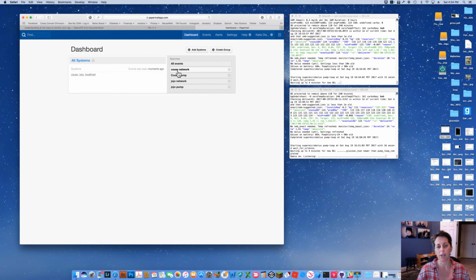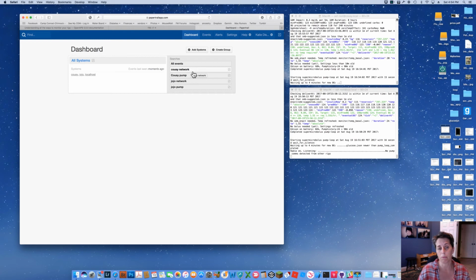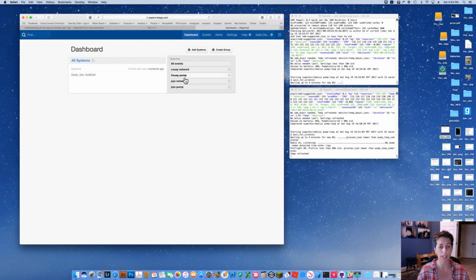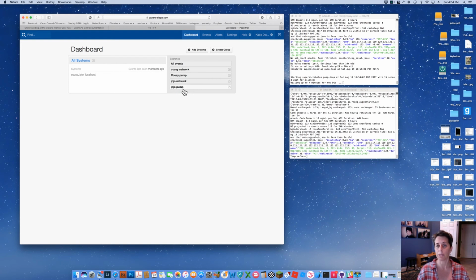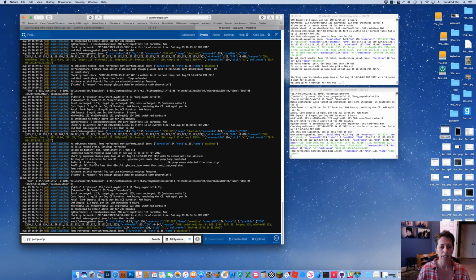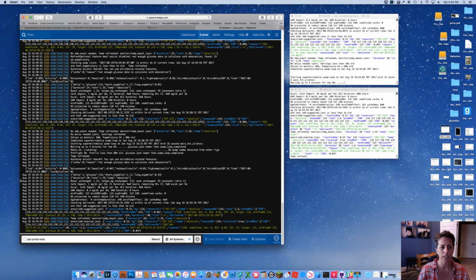Awesome. So now we have some really useful searches that can just be picked up and done. If you find that your loop is failing for some reason, your rig's not working, the first thing I recommend you do is go to Papertrail. If you have it set up, click on the rig that you wonder about and the pump filter. So click there and say, wow, why isn't it working? This is the screen that you would want to share with people online or look at yourself to say, what the heck is going on?